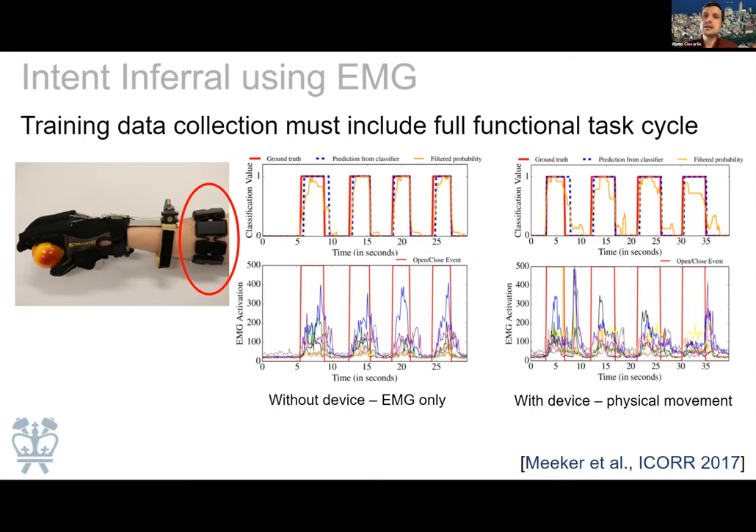Once we decided on the tendon patterns, we started building our first iterations. You can see an early design of our orthosis for assisting finger extension. We wanted to do intent inferral to detect when the person is trying to open their hand. The first sensor we tried was an off-the-shelf EMG armband made by a company called Myo, which unfortunately no longer makes them. It's a nice, low-cost, beautifully integrated device giving you eight EMG sensors on the forearm. We trained an intent inferral method to detect when the person is trying to open their hand.